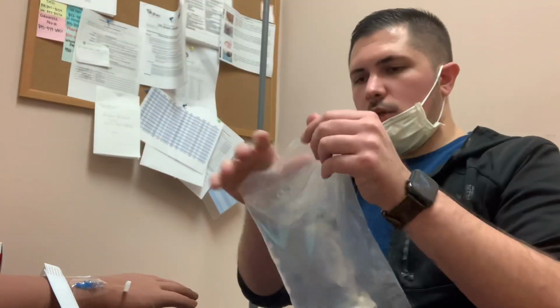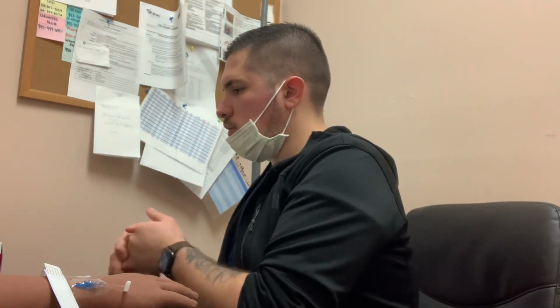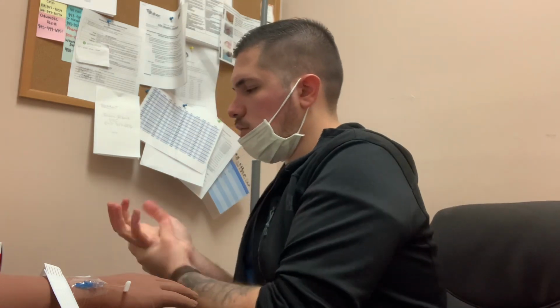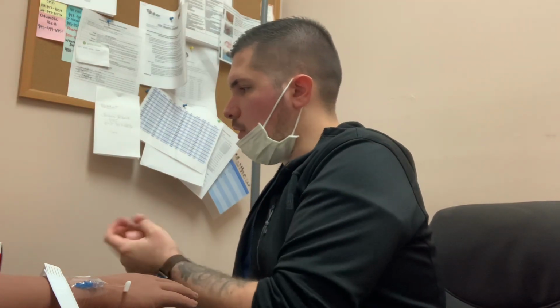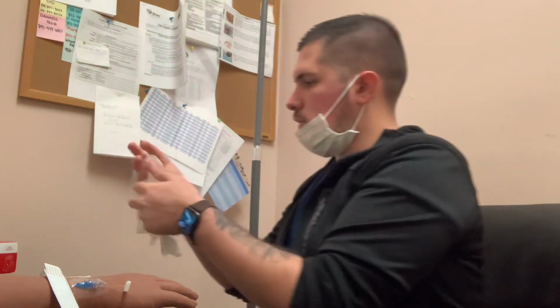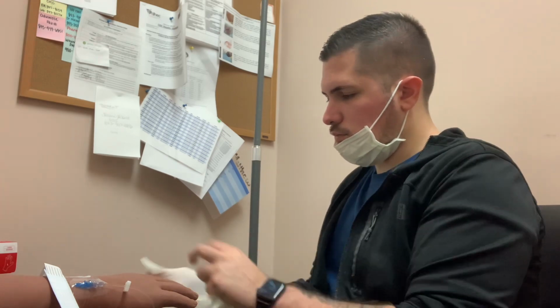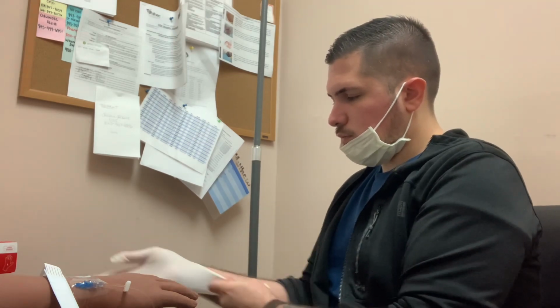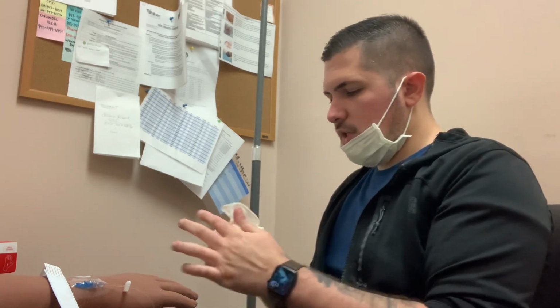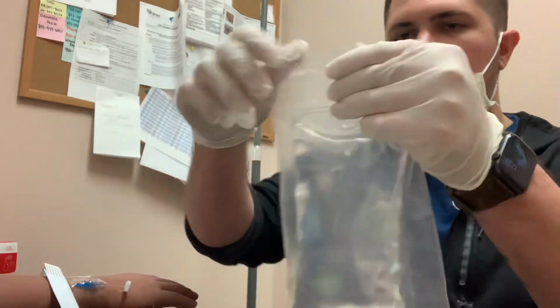Alright, so we're going to do our hand hygiene. I'm going to don some clean gloves. We're going to use aseptic technique when we're opening up our supplies.